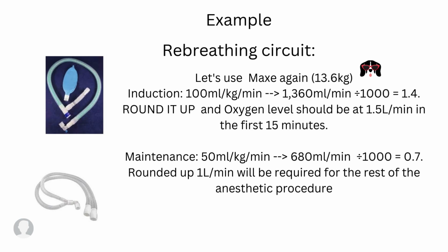For maintenance, I'm going to use 50 ml per kg per minute. That's going to give me 680 ml per minute. Gonna divide that by 1,000 to get my liters, and that's 0.7. I'm gonna round that up, and I'll get 1 liter per minute that will be required for the rest of my anesthetic procedure.